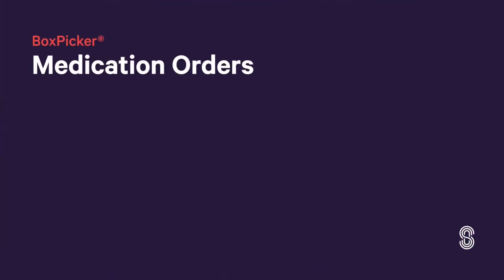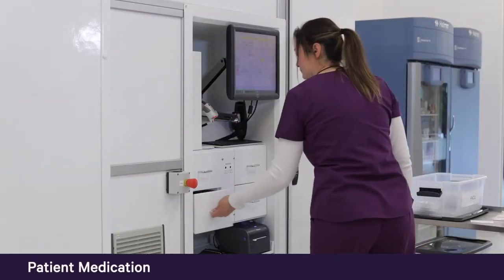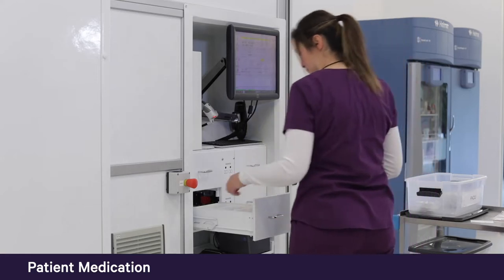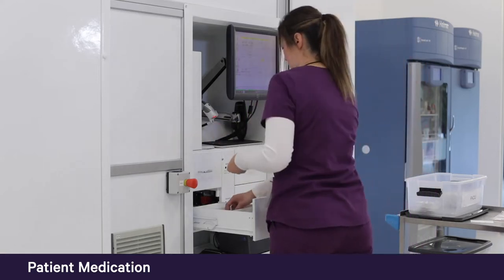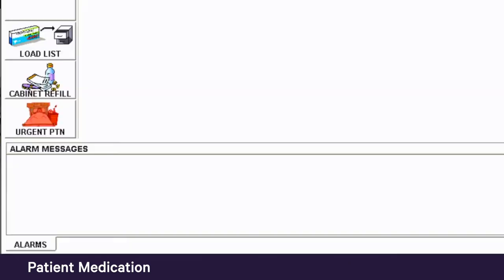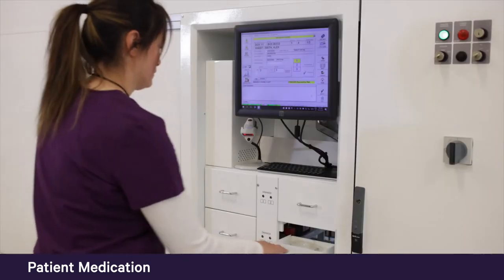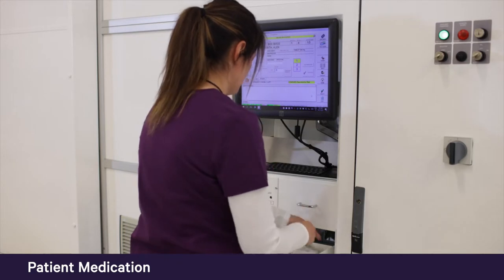Through real-time interfaces, each pharmacy determines which medication orders are sent to BoxPicker and when. Patient medication orders can come through a direct interface with the hospital information system or through Pharmacy Manager, Swisslog Healthcare's medication inventory management software. When stat or first dose orders are in the queue, patient prescriptions or cabinet refill buttons flash red to indicate high priority orders that need to be addressed in the system.